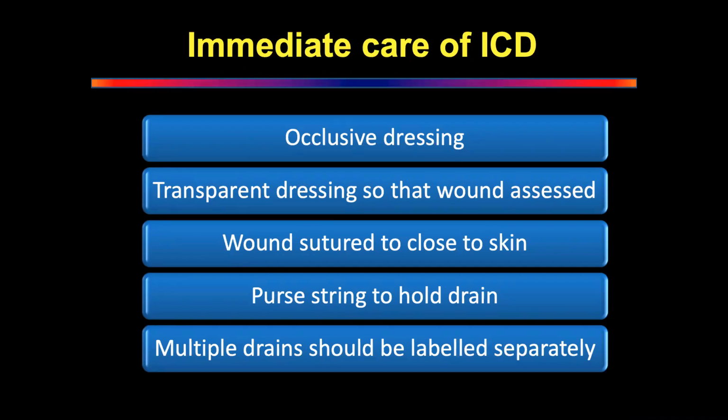The second thing is, can you actually use one suction for the 2 bottles if you're using wall suction, or do you need 2 separate suctions? We can use one suction, it'll suck for the 2 bottles, but 2 is preferred. Actually, in most clinical scenarios, you're not going to have 2 suctions available on a bed space. So you use a Y connector, and you put the suction on the 2 bottles. One suction, Y, but the bottles should be 2.